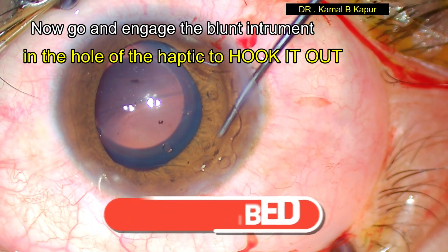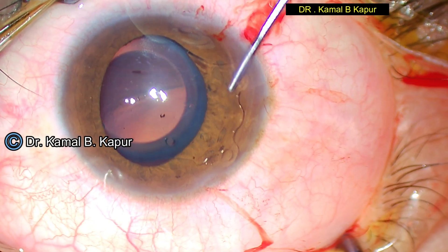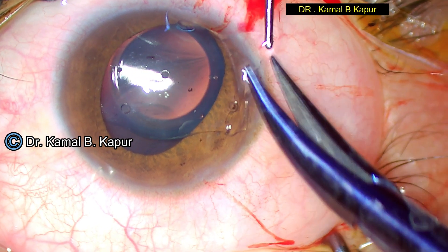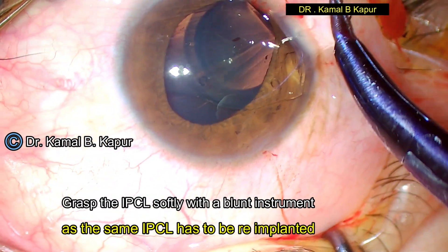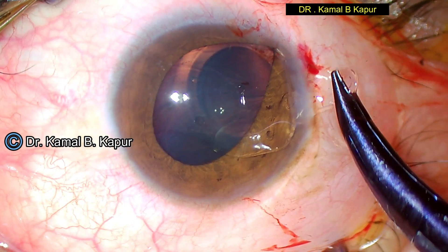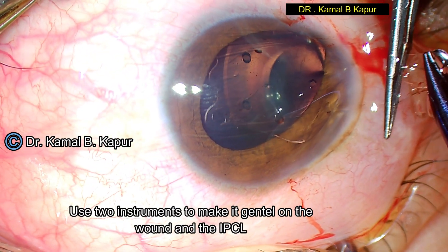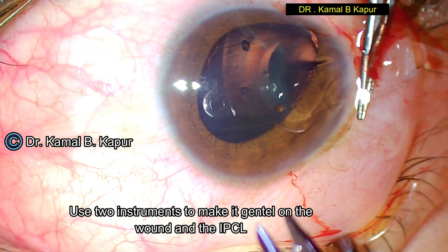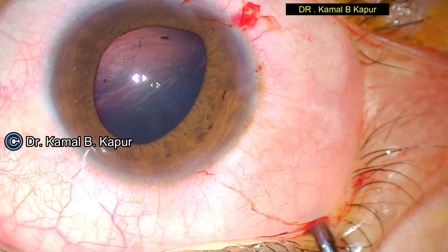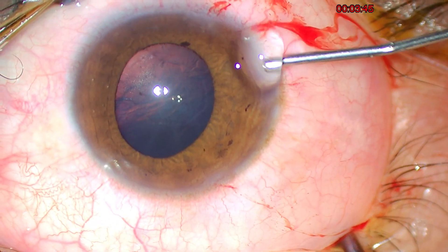I use my hook technique, which I have described in many previous videos, by engaging one edge of the haptic with a blunt instrument and then using a two-hand gradual pull-by-pull technique. We pull the phakic lens slightly, use another instrument to pull another part, and gradually pull-by-pull, pull out the phakic lens ensuring no physical damage is caused to the lens as it is brought out.